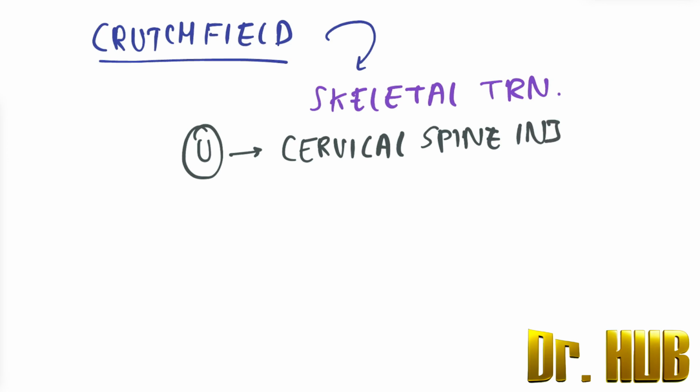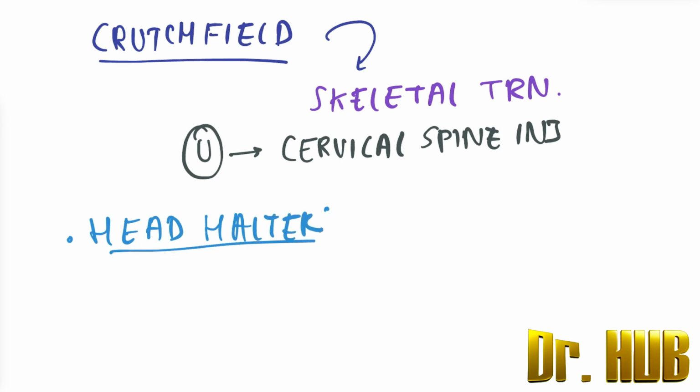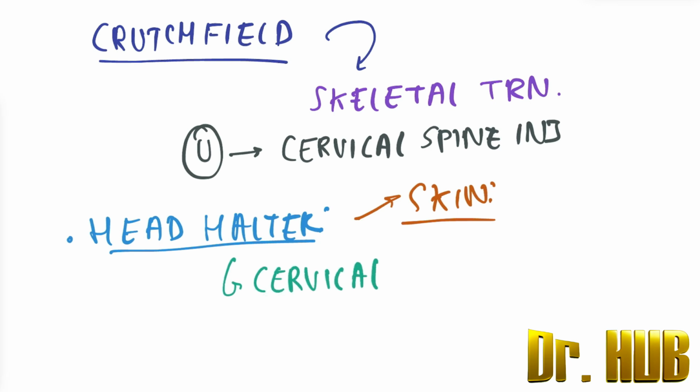Then we move on to the head halter traction. Under the head halter traction, it is a type of skin traction, as we discussed, and the use of the head halter is in terms of cervical spine injuries.